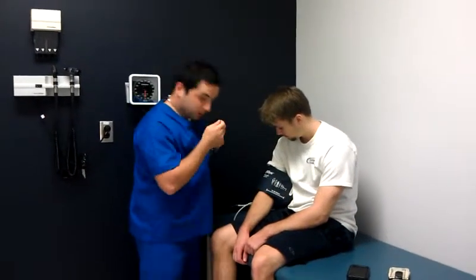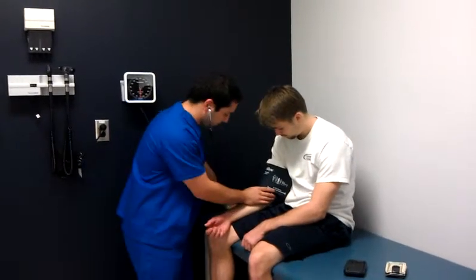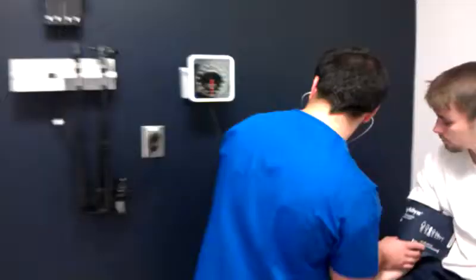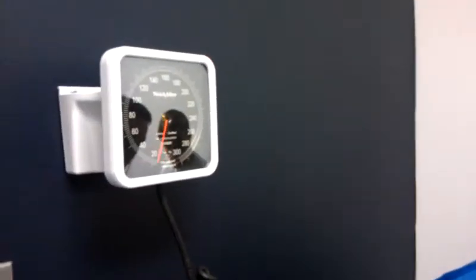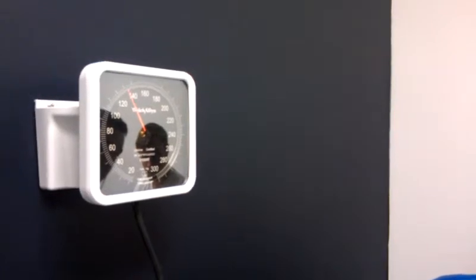Okay. Take my stethoscope, place the diaphragm of the stethoscope against the brachial artery. Okay. We're going to pump it up to 135. It's important to note the first two numbers of when the turbulence starts and stops.